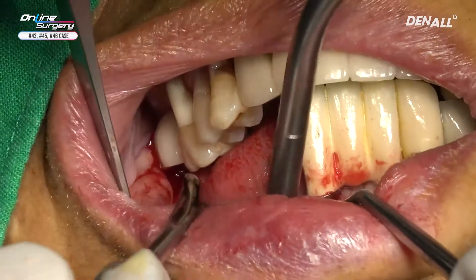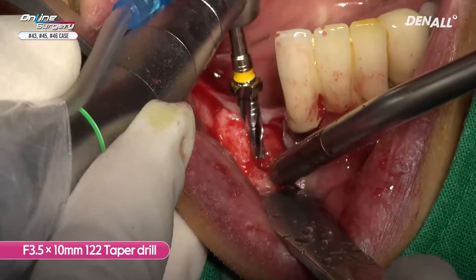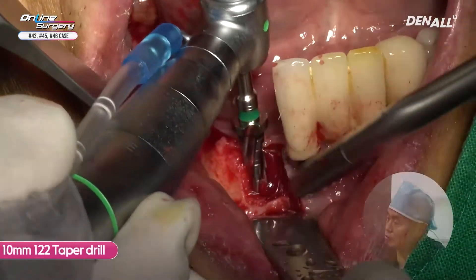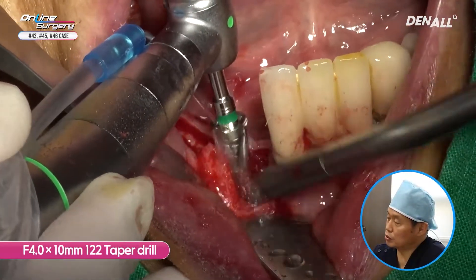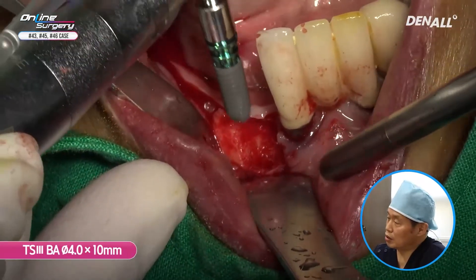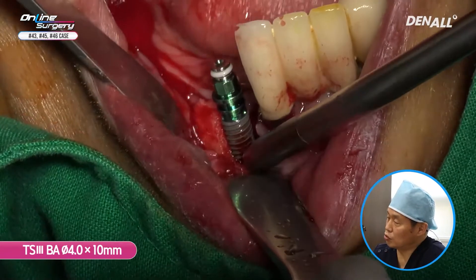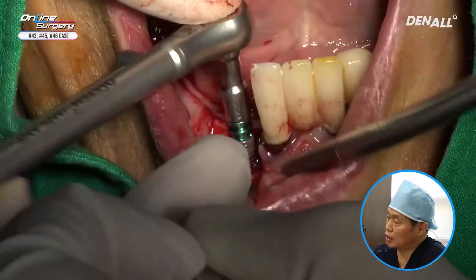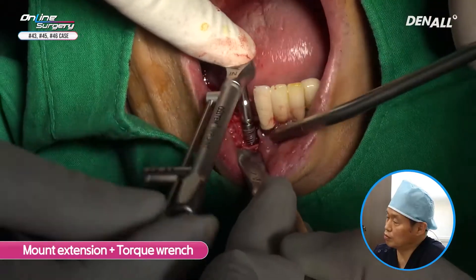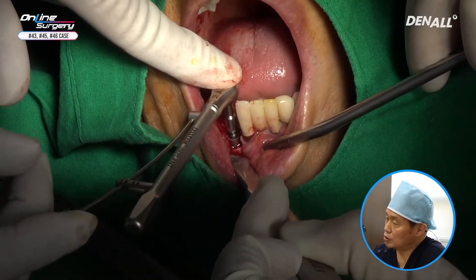Try to bite on your molars. Say ah. Don't move. As you can see on the labial side, there's a bone defect. Following the cortical bone height on the lingual side. TS3BA 4.0 by 10 mm implant. In the case of a hydrophilic implant, irrigate ahead before placement. Using a hand wrench, I'm trying to find the final position. On the labial side, the thread is exposed.